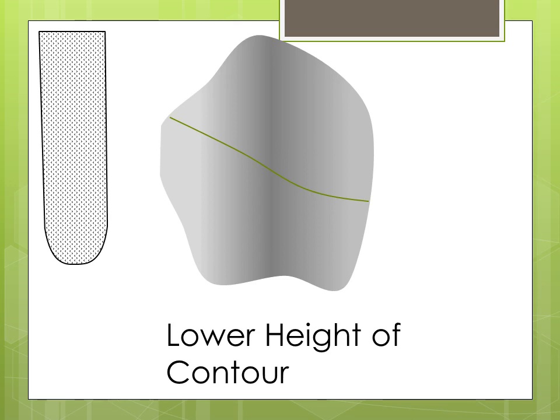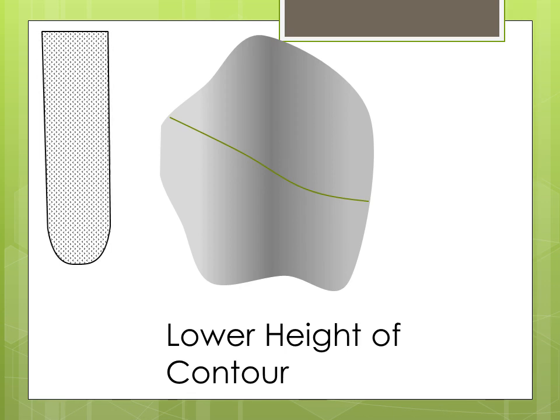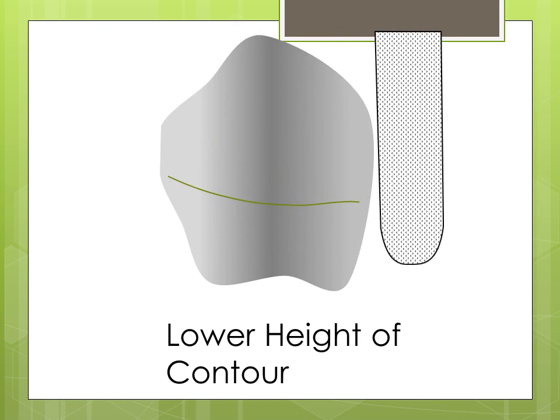Well, Marie, these clasps are simple to use and usually won't give you any trouble if used correctly. However, the origin and rigid portion of the cast circumferential clasp should engage the tooth in the middle 1/3. This is impossible if the height of contour is in the occlusal 1/3, as it frequently is. Therefore, minor enameloplasty, with all due consideration to tooth preservation and aesthetics, should lower the height of contour to the middle 1/3 for the bracing portion of the clasp. Of course, the flexible retentive tip should be in the gingival 1/3.